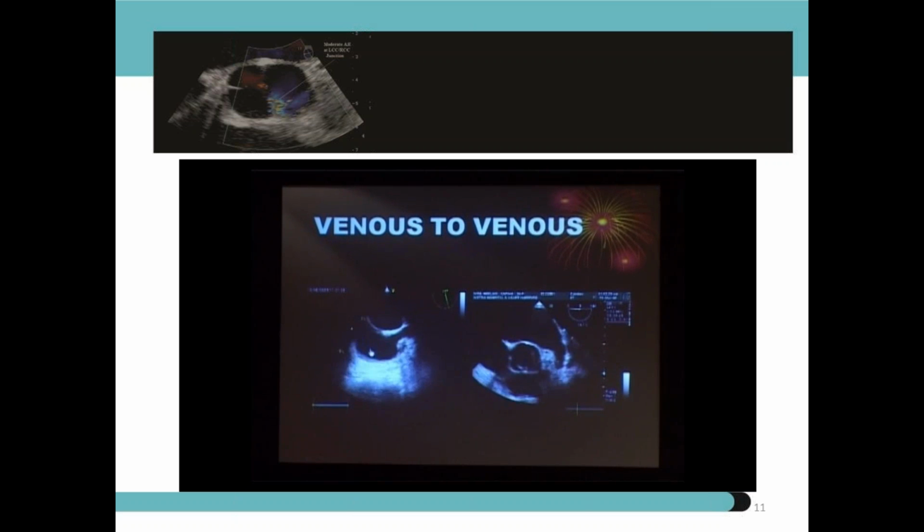So is the pulmonary valve blocked? You can see the circumflex artery opening here. You can see the position of the coronaries here.